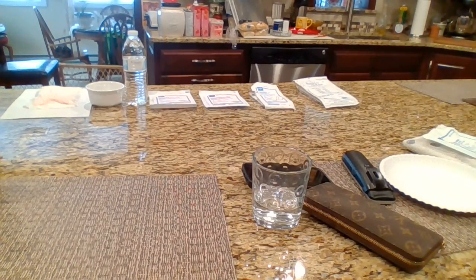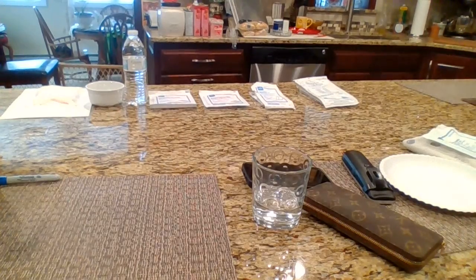After this, I'm going to label a piece of tape with my initials, the date, and the time. This is to put on over top the new dressing at the end. This will be the last step. I'm just going to set that off to the side.